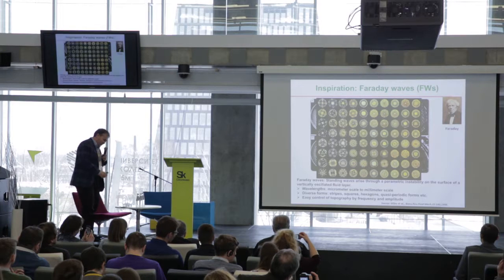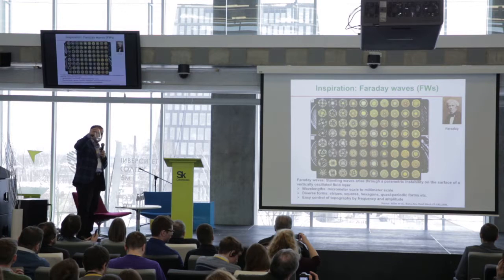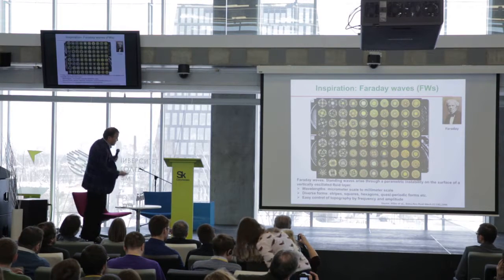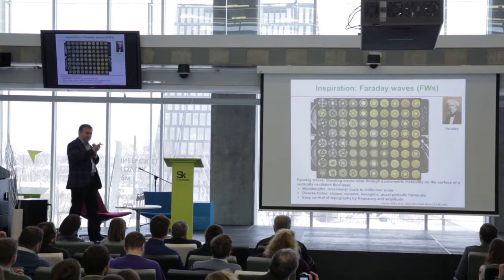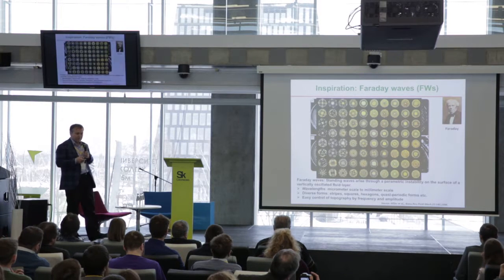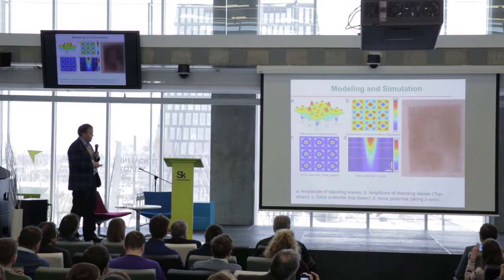Think about holding a glass filled with water and just going up and down, and it generates these vibrations that lead to very controllable, predetermined shapes. You can pre-enter the shape that you want your beads, cells, or spheroids to assemble into, and they will always take that shape because that's where the resonance is, which I'll show you later.